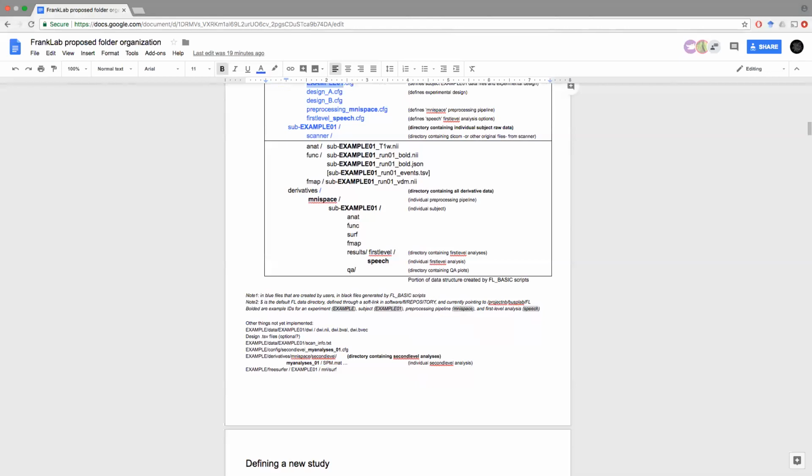Neither of the pipelines touches the original file that you feed into the pipeline, so that's perfectly fine. And you can actually use the T1 file as the origin for both an MNI space pipeline as well as for the surface-based pipeline. So that typically works fine. MNI space normalization already has all of these intensity normalization things and all of the matching of the Gaussian intensity profiles for each tissue class and all of that integrated into the normalization step.